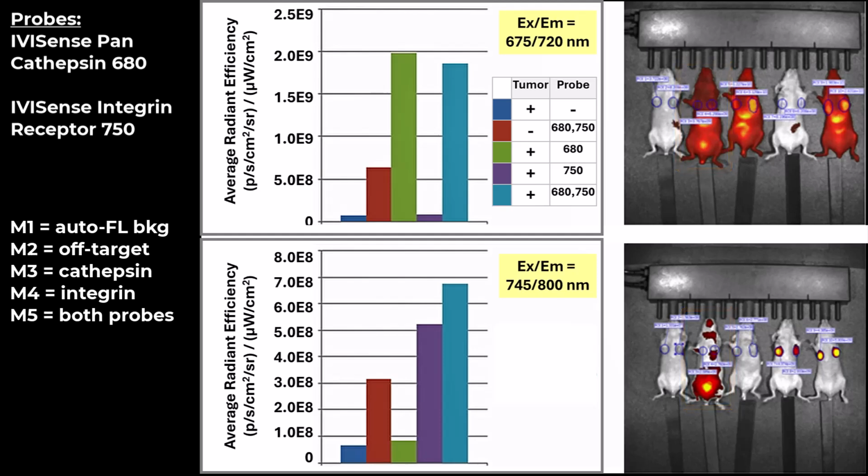The tumor sizes and location are in strong agreement with bioluminescence imaging performed earlier. Yet, these fluorescence agents provide additional biological information. Quantitative analysis provides good agreement with the tumor imaging. But, it is important to note that the signal magnitude by bioluminescence imaging would not be expected to correlate perfectly with the near-infrared fluorescence. Bioluminescence provides readout on tumor burden, whereas fluorescence provides biological marker quantification.